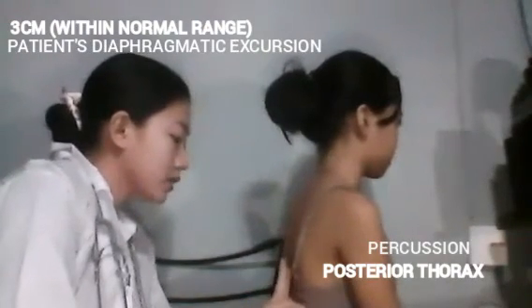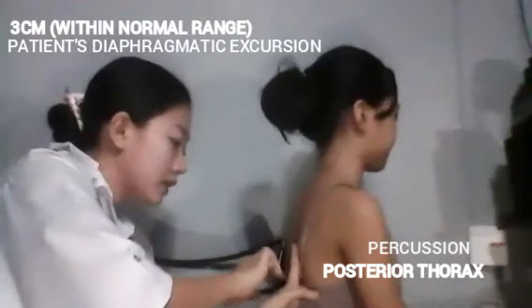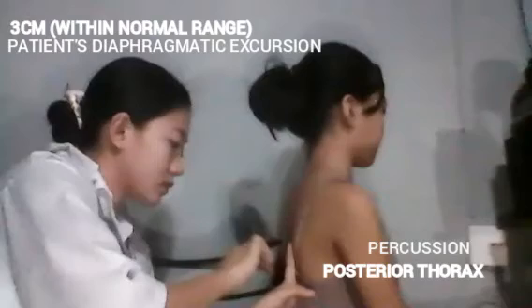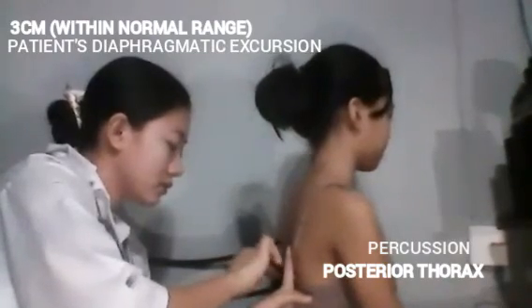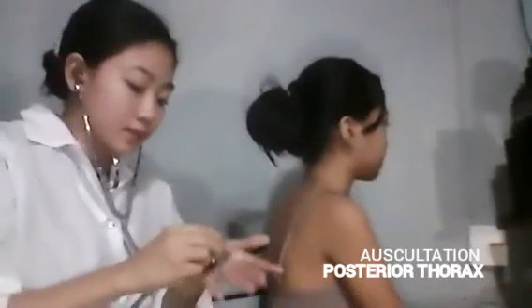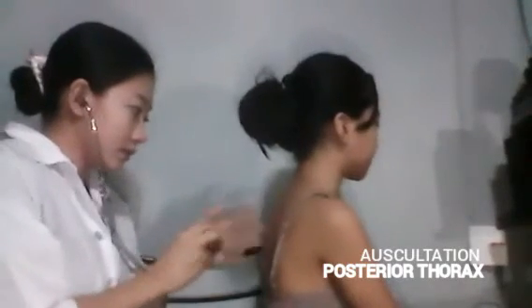Okay, I want you to inhale and exhale. Ma'am, I want you to inhale and exhale for me for later. Now we're going to start to auscultate our patient. I'm just going to check for any abnormal breath sounds. We're just going to warm our diaphragm. So, I'm just going to start.